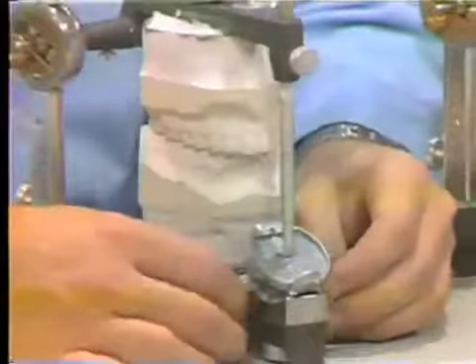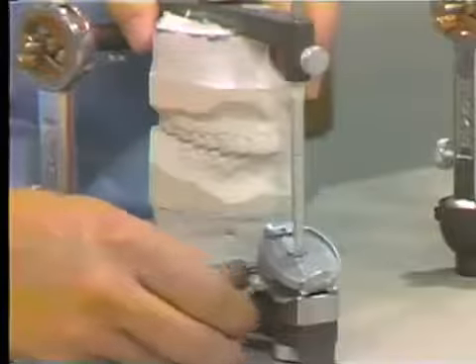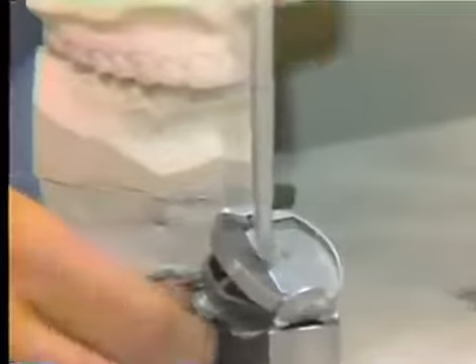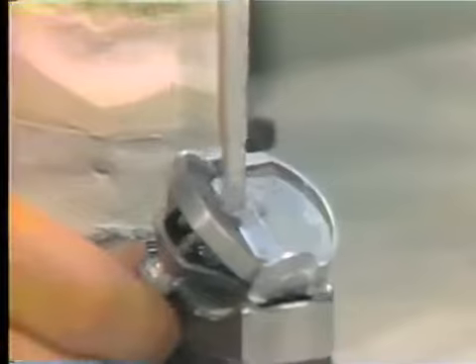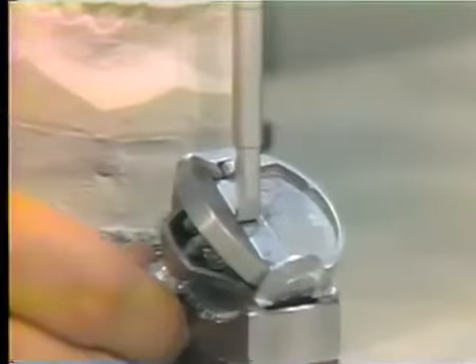And also, the lateral wings of this incisal table can be raised enough to duplicate the lateral incisal angle. See here, we can move the articulator without abrading the stone surfaces of the teeth.